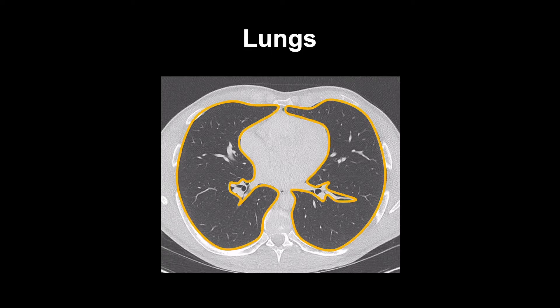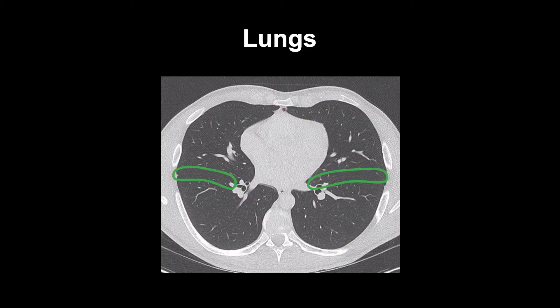In normal lungs, you see background lung tissue, the larger airways and vessels, and the fissures. The background lung is 20% tissue and 80% air, and has a certain uniform grayness that you'll learn to recognize. It is lighter than the black color of the airways, but darker than the light color of the subcutaneous fat.